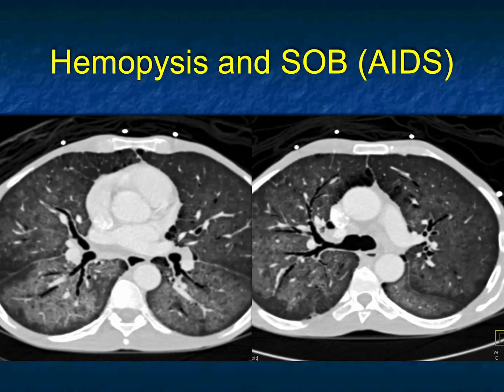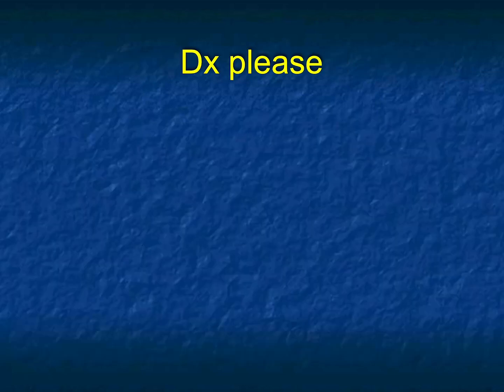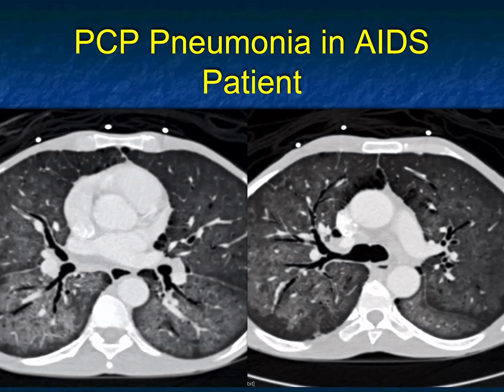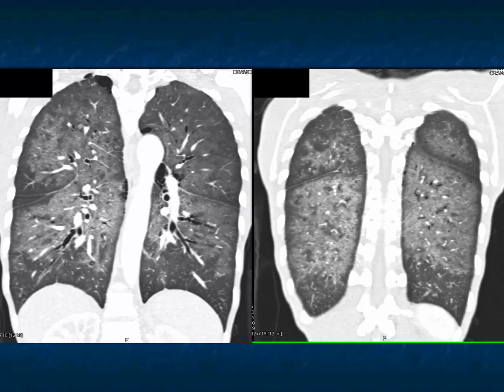This patient has hemoptysis and shortness of breath, and the history was AIDS. You could think about edema, and in this era of COVID you could think about COVID, but it doesn't look like COVID. What gives you ground glass infiltrates bilaterally — look how the bronchi stand out. Certain infections are more common in AIDS patients. Pneumocystis is the thing we think about, and this indeed was Pneumocystis pneumonia in an AIDS patient — a very nice example, also shown on the coronal view.